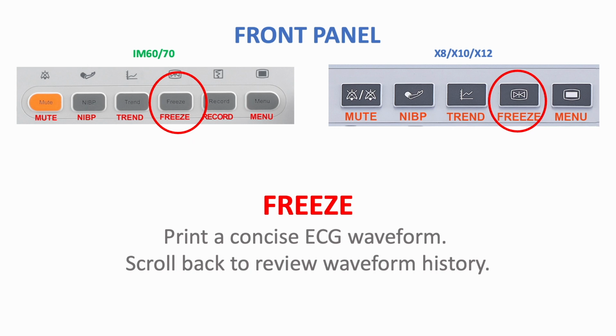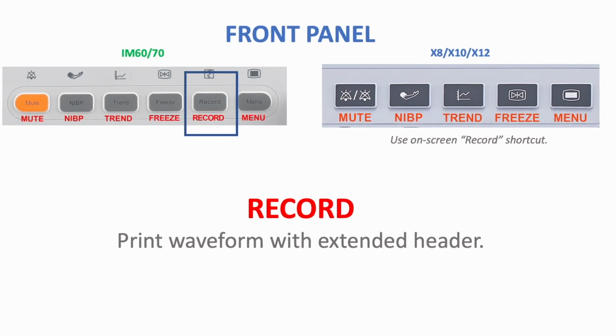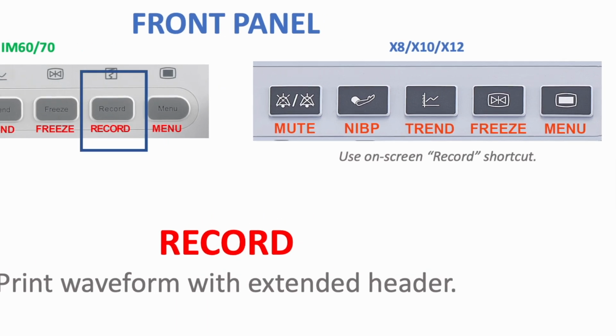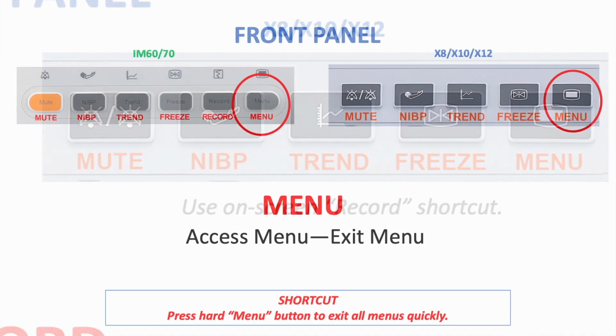Press the Freeze button and then Record to print a concise ECG waveform. It can also be used to view waveform history. The Record button prints a waveform with a complete patient information header. The waveform prints out according to the recorder setup menu. The X series monitor does not have a record button, however a shortcut can be added to the control bar.